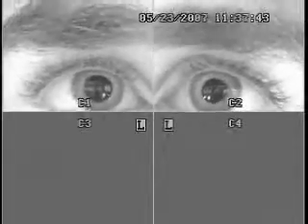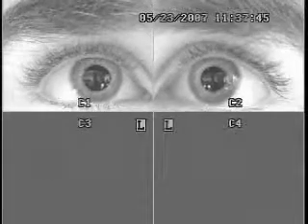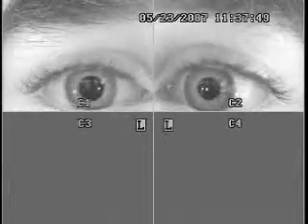Now we're going to check for lack of convergence. We're going to move the bead around your eyes — just follow it with your eyes. Good. And, once more.